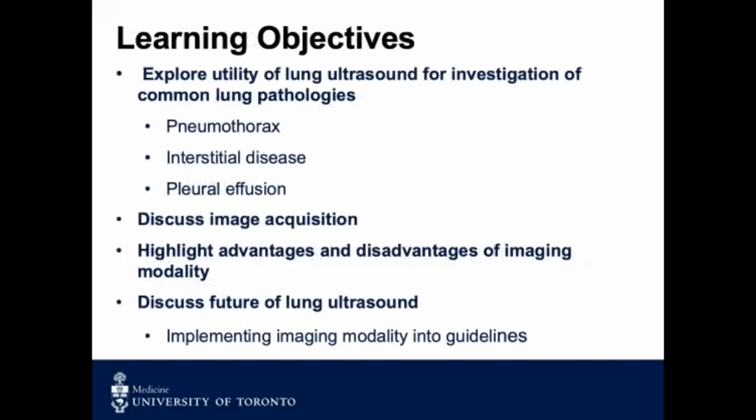Just to orient you, first we're going to talk about the utility of lung ultrasound for some common lung pathologies. We'll discuss some image acquisition, and I promise it's a lot easier than cardiac echo. And we'll talk about some of the advantages and disadvantages, and then we'll discuss how ultrasound, specifically lung ultrasound, is being implemented into our guidelines.